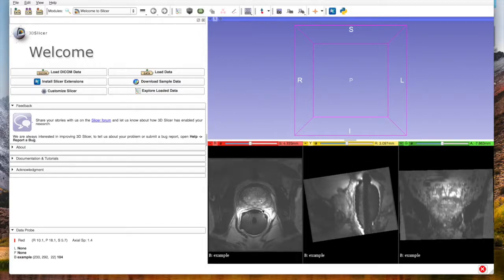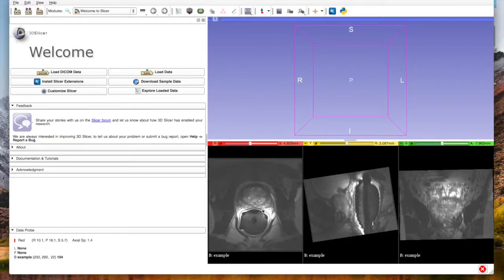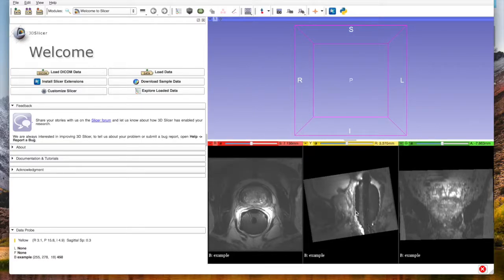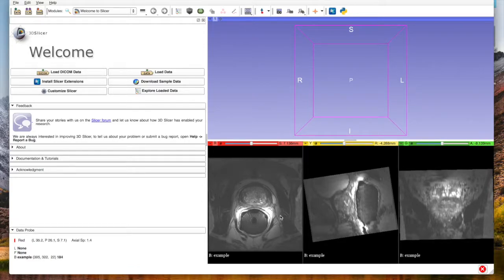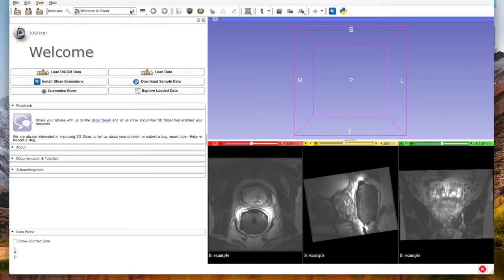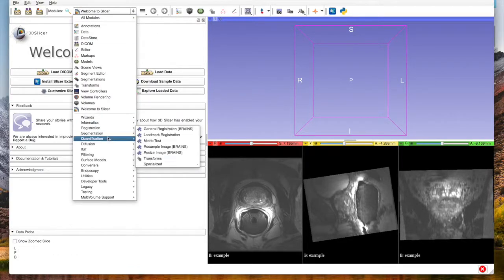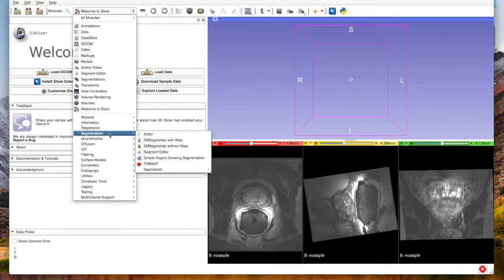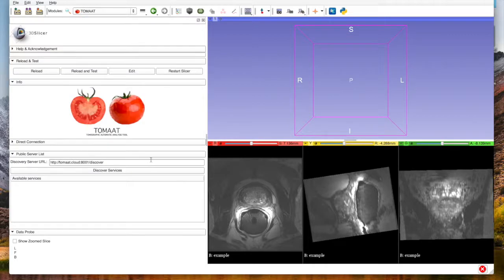We can scroll through it, visualize it, and now since we have Tomat, we can also process it. In this case, the processing will be segmentation. We can go to segmentation here where we can find Tomat. We click on Tomat.